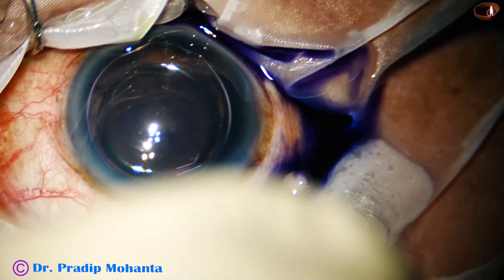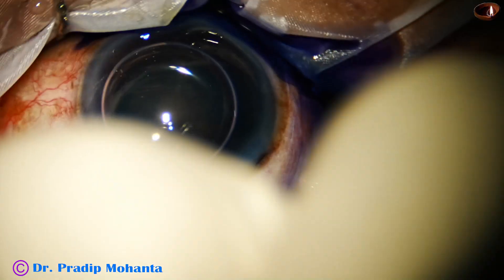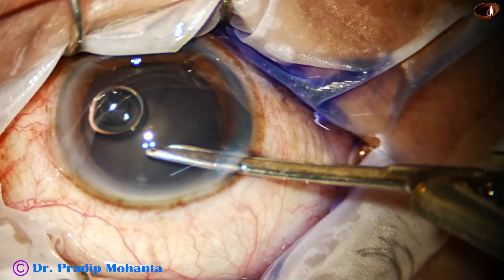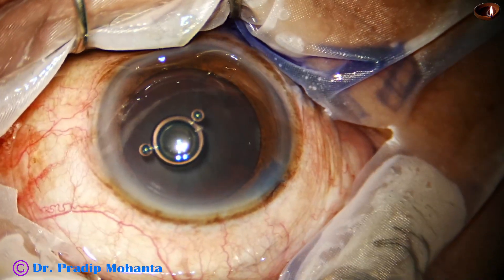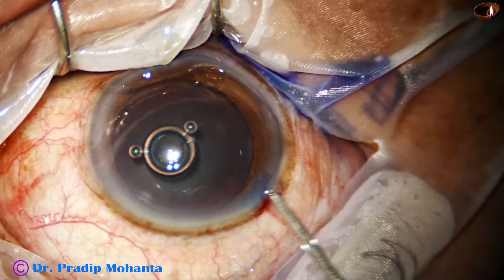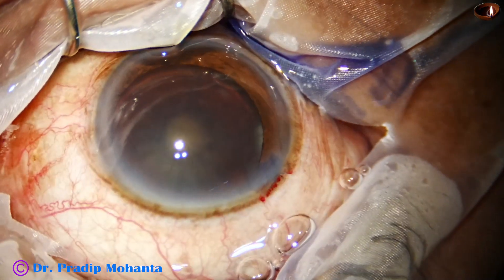By this time, the main incision has been made and the anterior capsule has been stained with trypan blue dye. Now the dye is being washed out with a 23G Simcoe cannula, and then the anterior chamber is filled up with 2% hydroxypropyl methylcellulose.